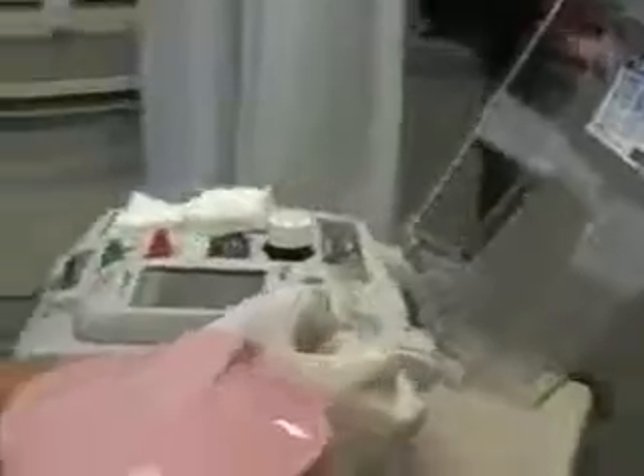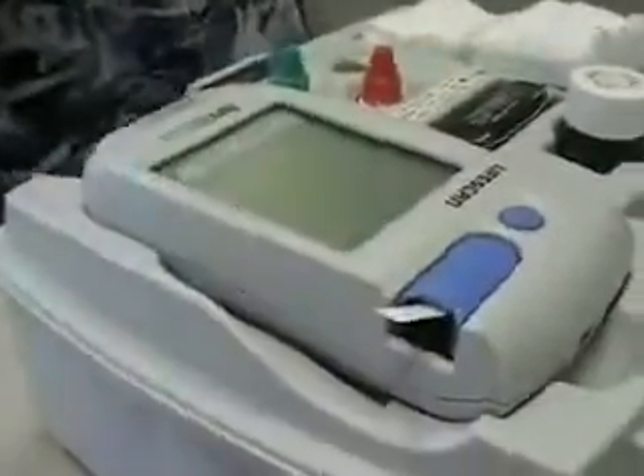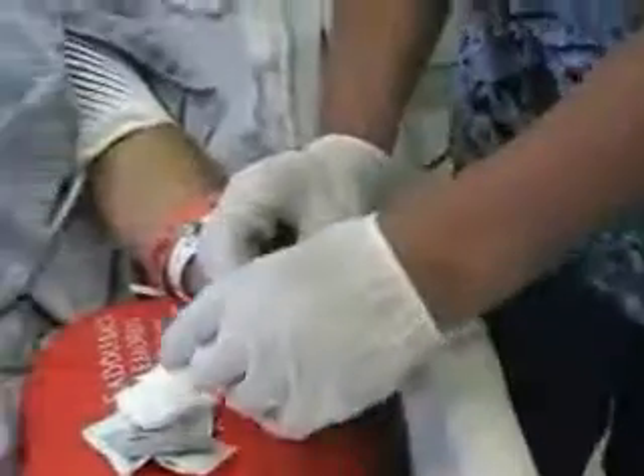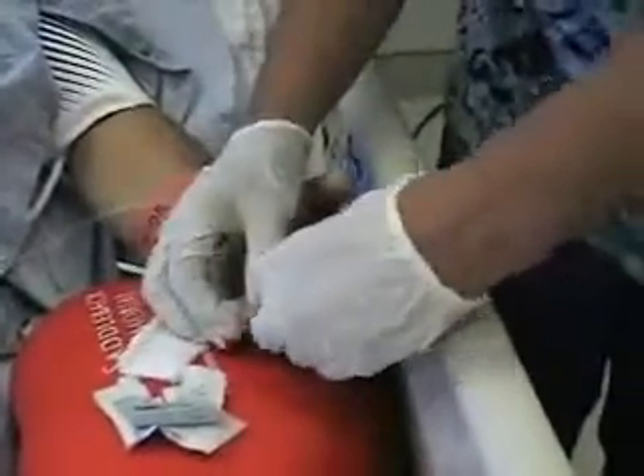Take it face up — that's a good drop. Take it face up and slide it right in. And then as we're putting it in, you do want to hold a little pressure onto the side of your patient. And if they're awake, alert, and cooperative, you can ask them just to hold a little pressure there for me, please. As you discard.